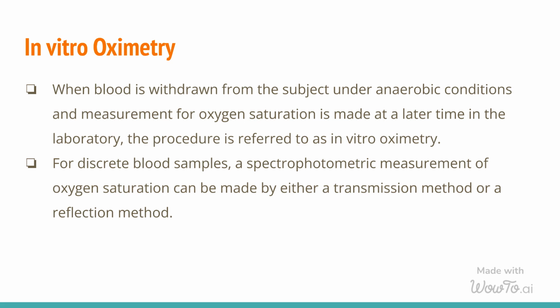In vitro oximetry is commonly used in medical research and diagnostics to study oxygen levels in blood samples, as well as in quality control processes for medical devices and pharmaceutical products.